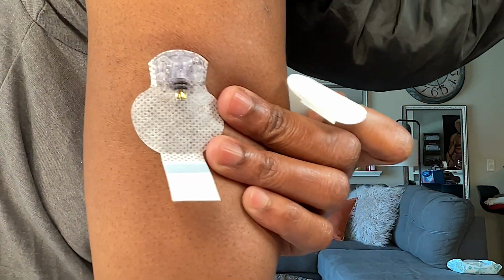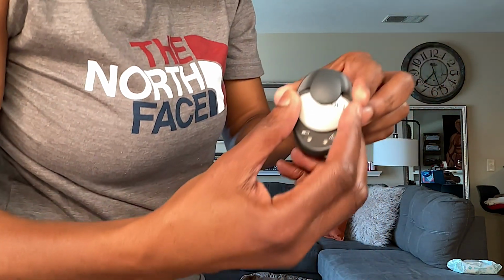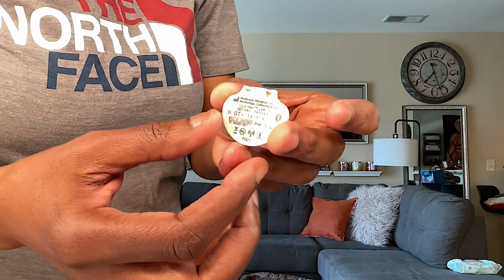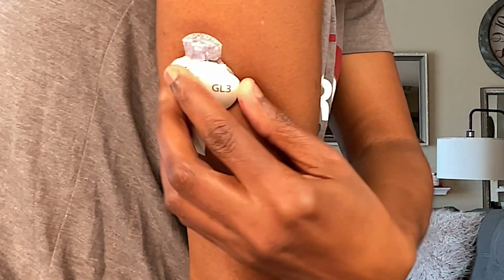So this is what the sensor looks like. Now I'm gonna attach the transmitter. So I'm gonna remove it from the hub. So this is what the transmitter looks like. It should have a green light flashing very soon to show me it's alive. I'm gonna take this and attach it.